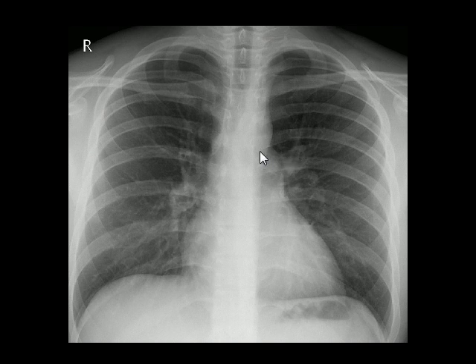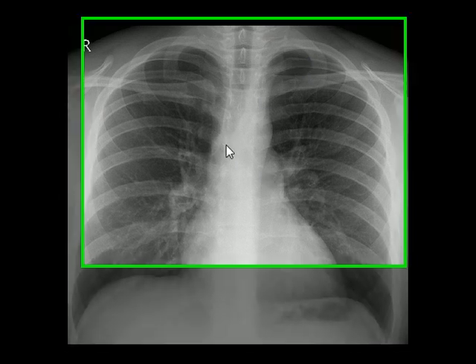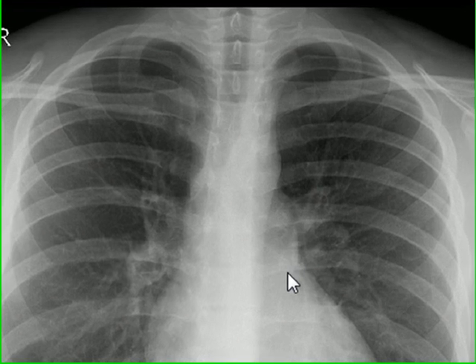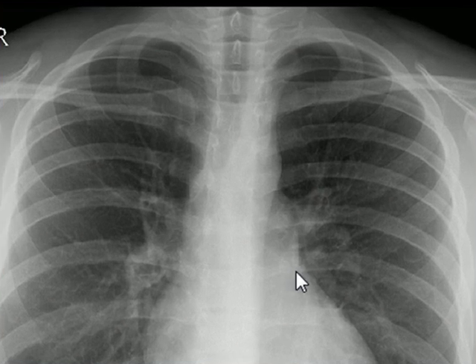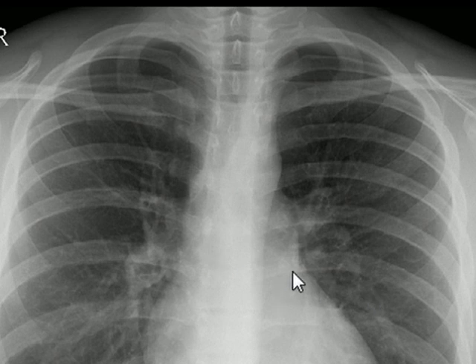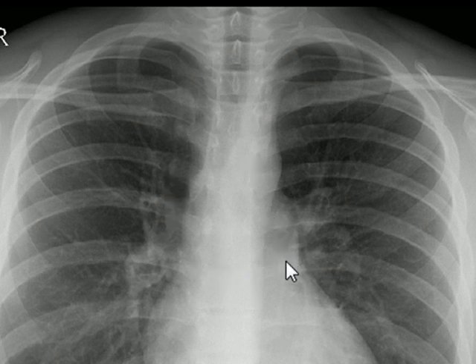A chest X-ray PA view is in front of us and we will discuss upper mediastinal structures as seen on a PA view. To identify an abnormality it is important to have a good understanding of normality, and today's objective is to learn about normal anatomy just above the hila as seen on a chest X-ray.